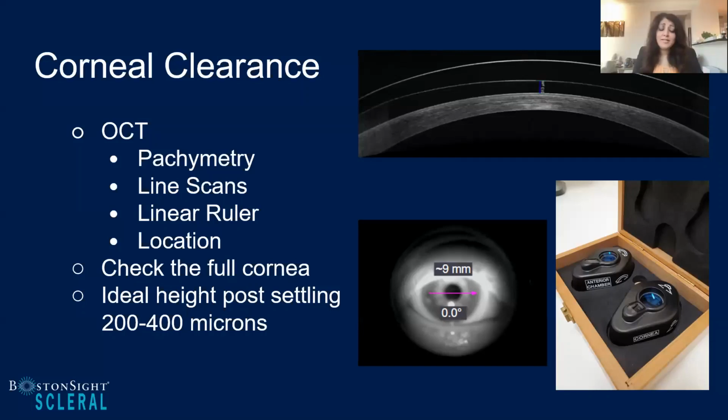Yeah, it's so true. When you have a cone where you have 50, 60 microns at the top, and then you've got an edge clearance of 500, 600 microns, it's hard to get that even pattern all the way through. Exactly. It's true.